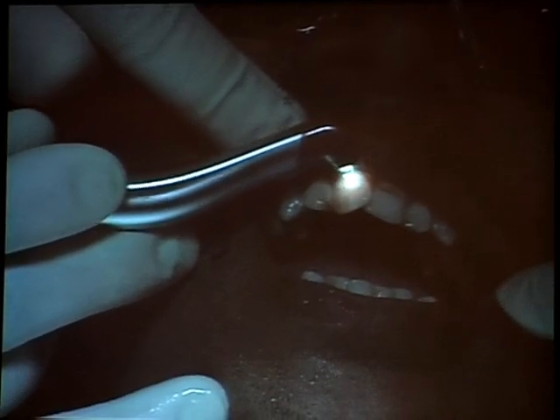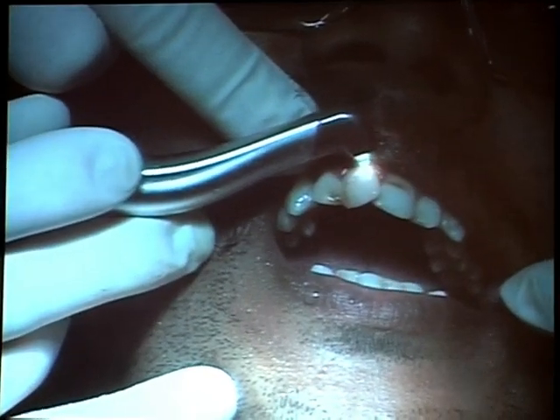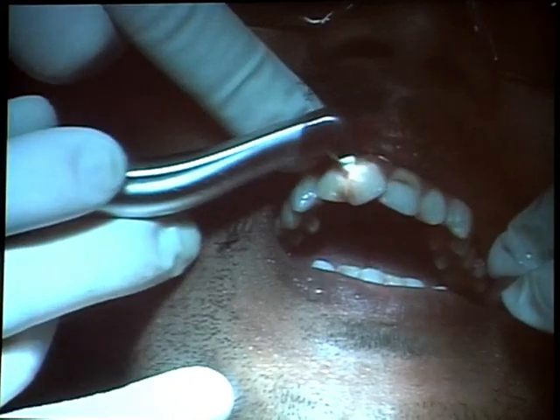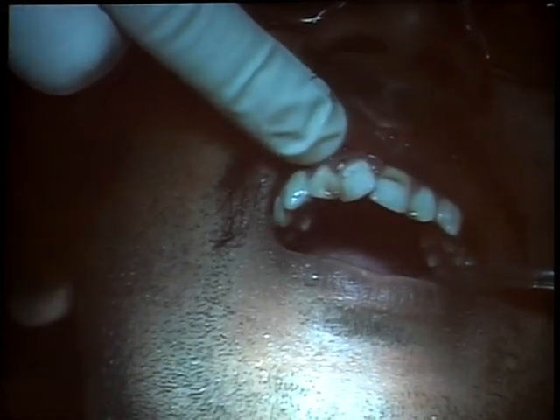Now he's going down. See, now he's lasing downwards. He's not going into the brown spot. So you see, now you can see how accurate. Really everything of the brown field is gone.